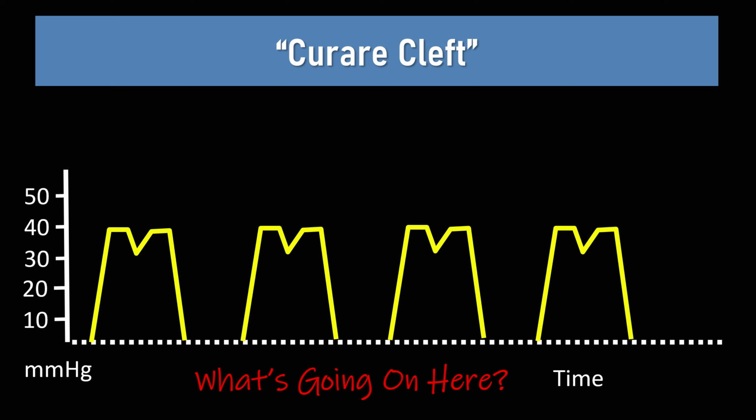There's not a lot to be done with this. You can look at your options to see, for example, if you're only halfway through the operation, the administration of further neuromuscular blockade may be needed. If it's at the end, you can reverse the patient, and if the patient starts to breathe up, they can be transitioned over to, for example, pressure support ventilation.